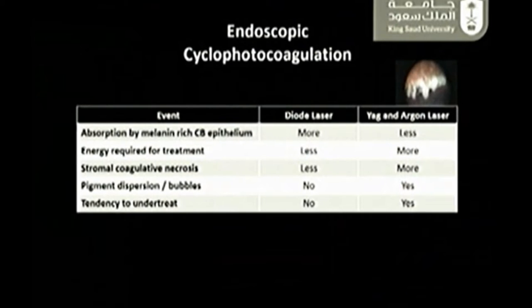And the stromal coagulative necrosis is less with diode laser. Therefore, you have less chance of having hypotony. Pigment dispersion and bubble formation don't happen with diode laser compared with YAG and argon. And the tendency to undertreat is therefore almost obsolete with diode laser compared with YAG and argon laser.